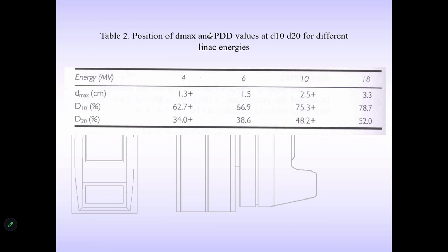When I get a dose at 10 centimeters, if I divide it by this percentage, it gives me the dose at 1.5 centimeters. And that is what I want.